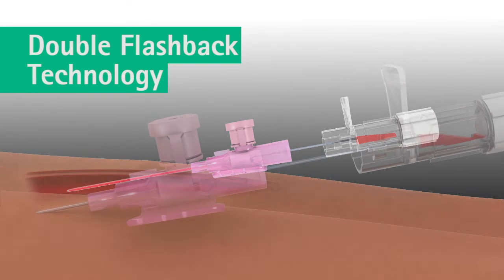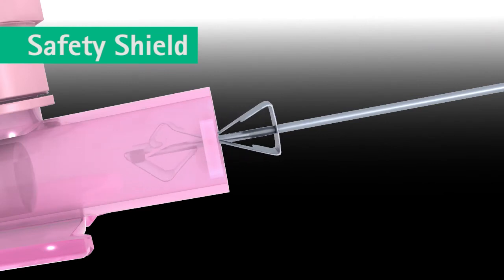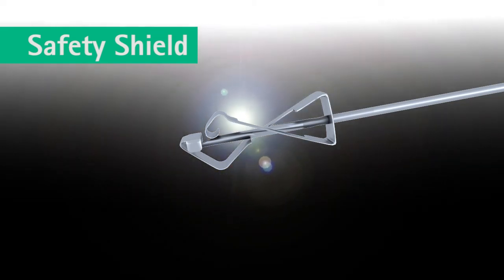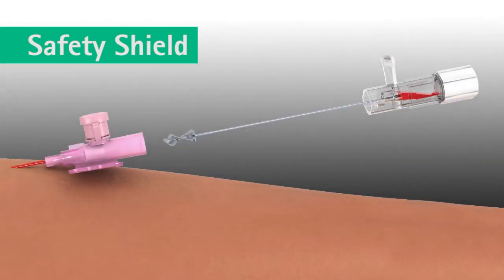Once the catheter is advanced completely, the needle is withdrawn in a swift, continuous motion. The safety shield on the B. Brown Varsafix safety IV catheter engages as the needle tip passes through the catheter hub. It deploys automatically and permanently shields the needle tip. This safety feature cannot be bypassed and is designed to protect against needle stick injuries.